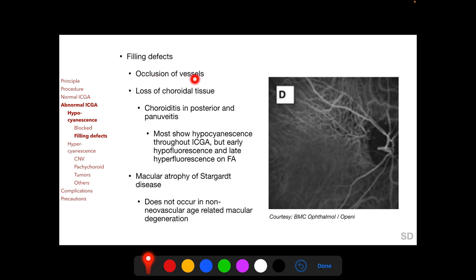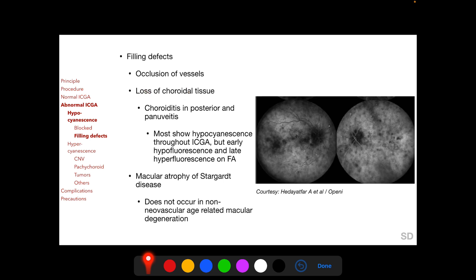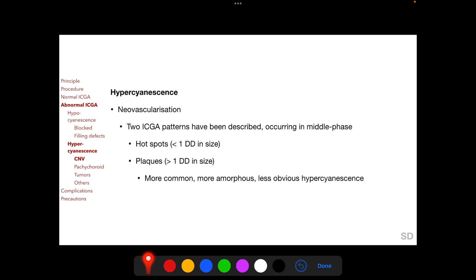Filling defects can also result in hypocyanescence, which may occur with occlusion of choroidal vessels, as seen here, or loss of choroidal tissue, as may occur in active choroiditis — seen here bilaterally in these angiograms. Most active choroiditis lesions show hypocyanescence throughout ICGA, but on FA demonstrate early hypofluorescence with late hyperfluorescence. Hypocyanescence on ICGA is also seen in macular atrophy of Stargardt's disease, where there is complete loss of choriocapillaries in the atrophic area. However, geographic atrophy in non-neovascular age-related macular degeneration does not show ICGA hypocyanescence, making ICGA a modality to distinguish between Stargardt's disease and geographic atrophy.